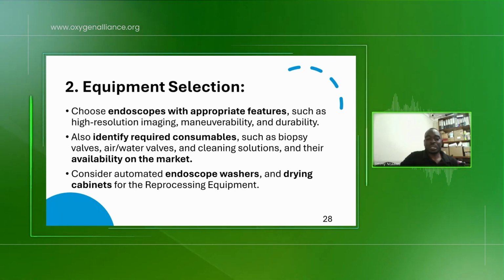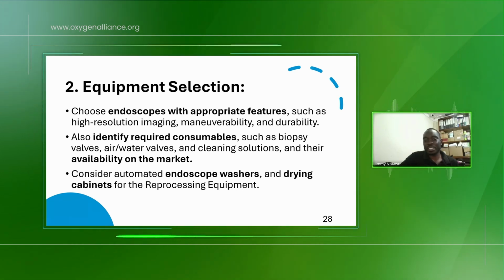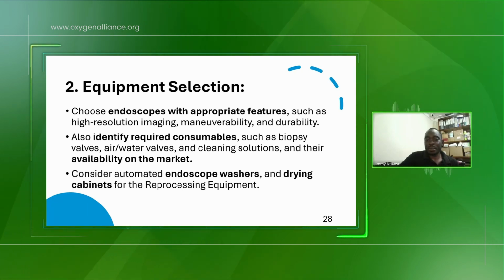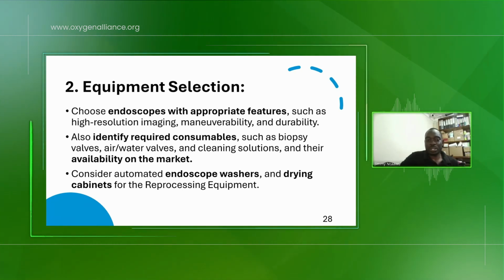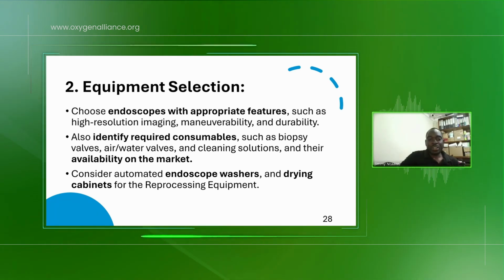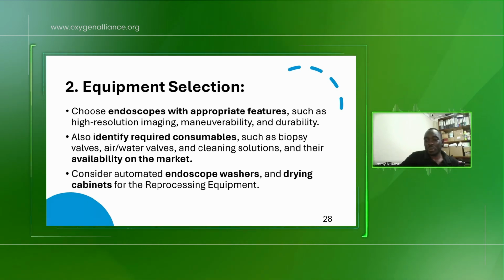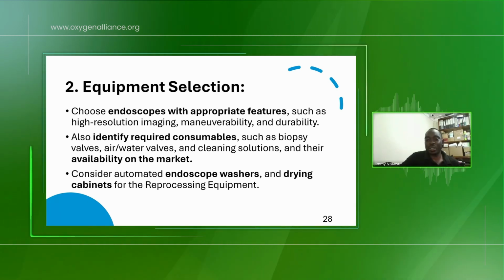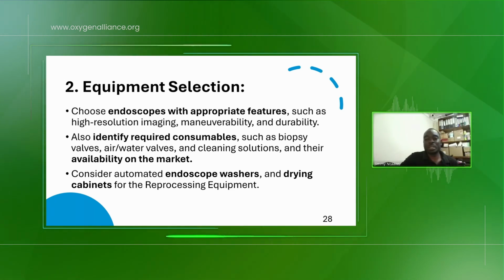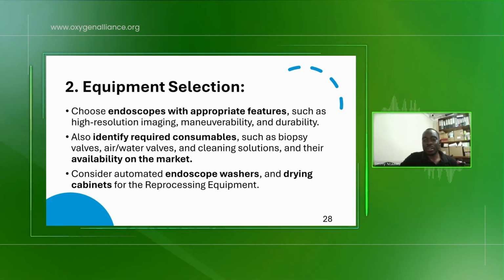The air water valves and biopsy valves, you can get from the manufacturer or from the person representing the manufacturer. Cleaning solutions are common. There are many on the market. Different suppliers have different cleaning solutions. Then the availability on the market, how available are they? If you're handling so many scopes, you can equip yourself with what we call endoscopy washers. Endoscopy washers do the whole cleaning of the scope for you. That means the scope is not going to be in people's hands very often, and therefore you're minimizing the poor handling of the scope.